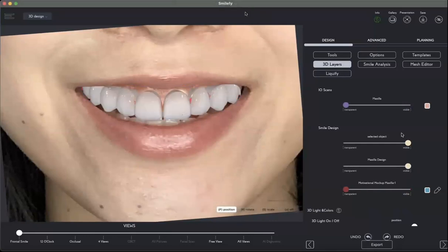You may ask, why do you work on time? Because time is the most valuable asset that we have. The vision is to create the SmileFy platform with all the details in the smile design decision.